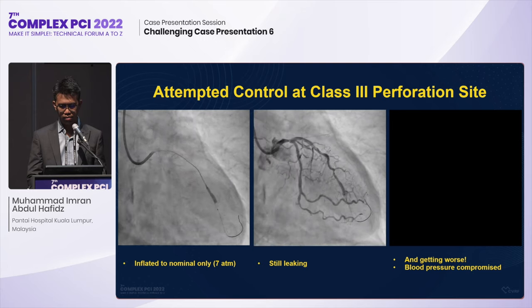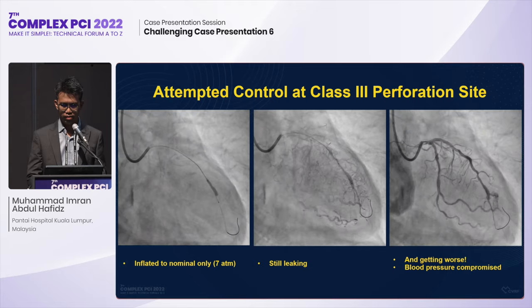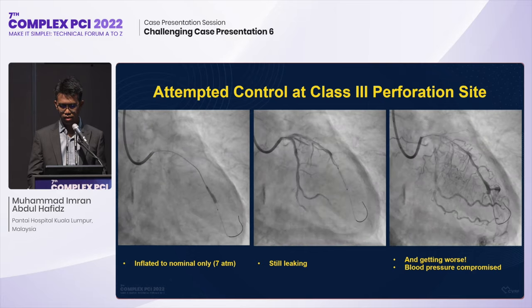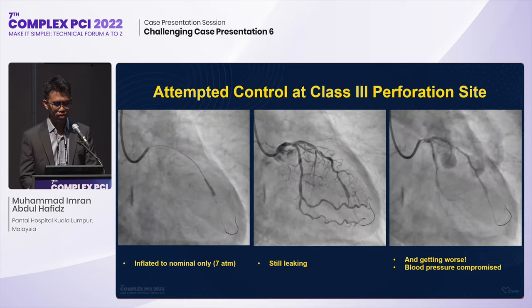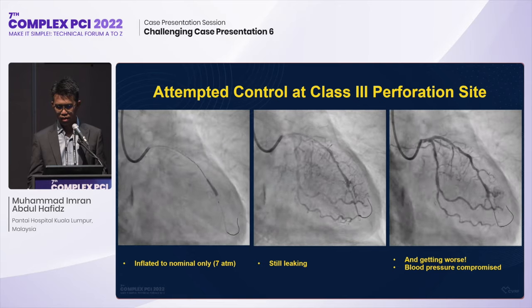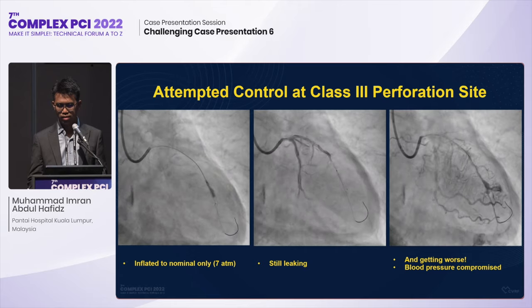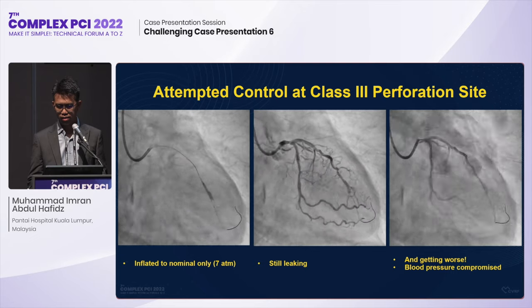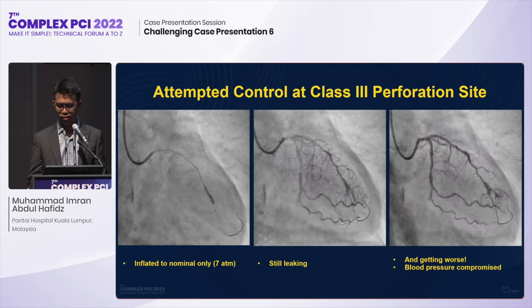Inflate covered stent. You can appreciate in the middle panel, the leak remains at the distal edge of the stent. Okay, and this is despite the stent actually, as you can appreciate earlier, the stent actually managed to cover both ends of the leak. So a bit of a tricky situation here. And as you can see, even though I tamponade, the leak is getting worse. So I kind of suspect that there was a malfunction with the covered stent as well. And you can see the active extravasation of contrast into her pericardial space.